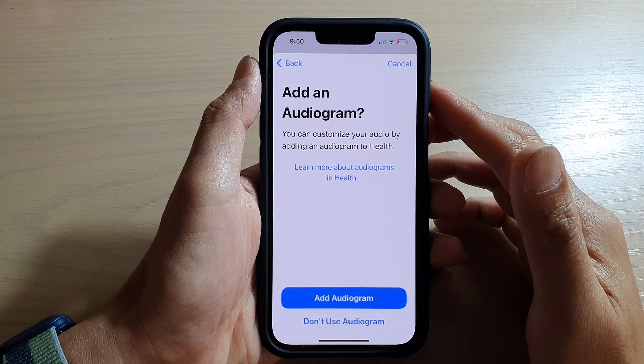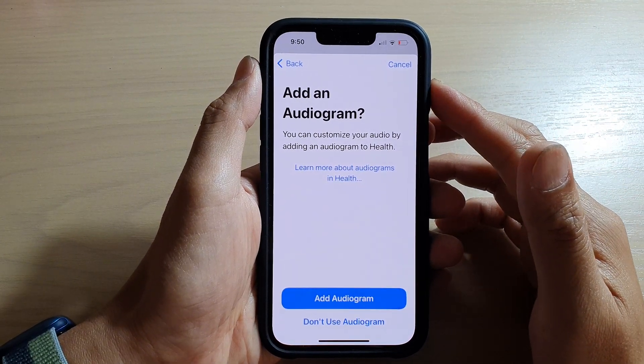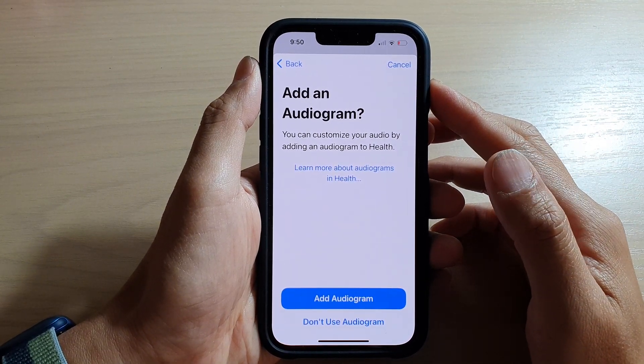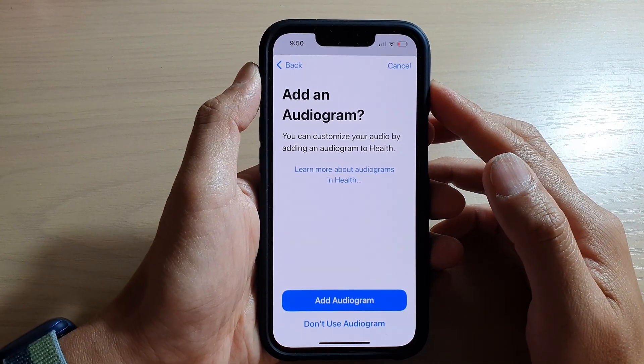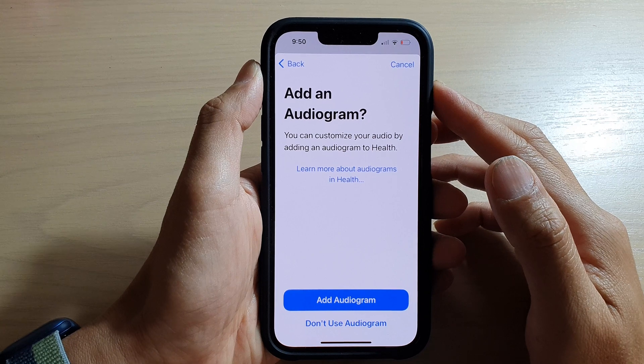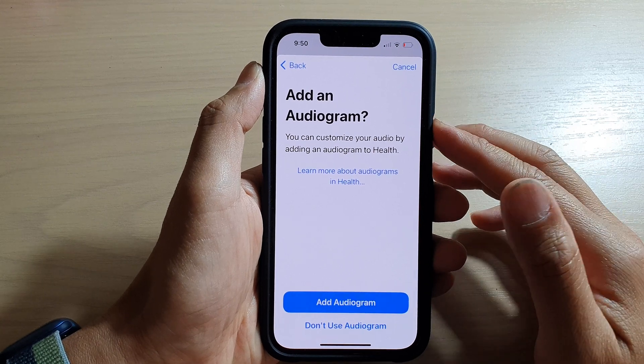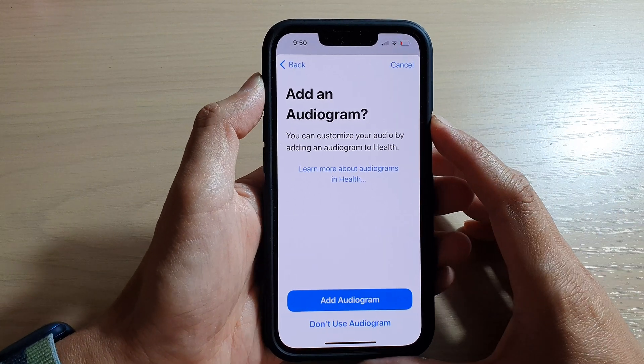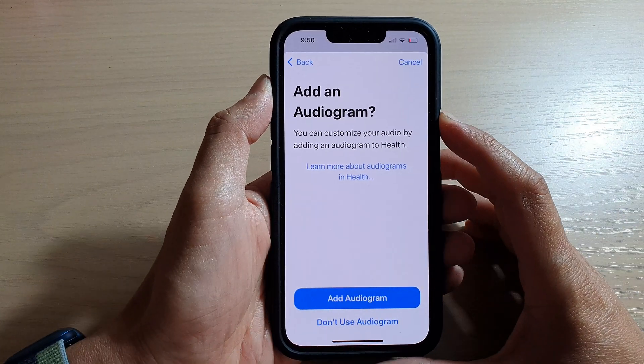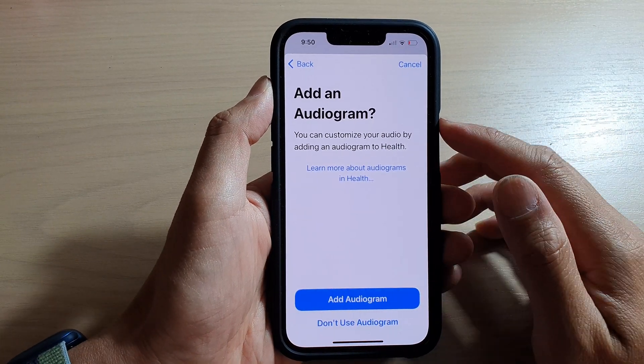Hey guys, in this video we're going to take a look at how you can add audiogram data to Health on the iPhone 13 series.